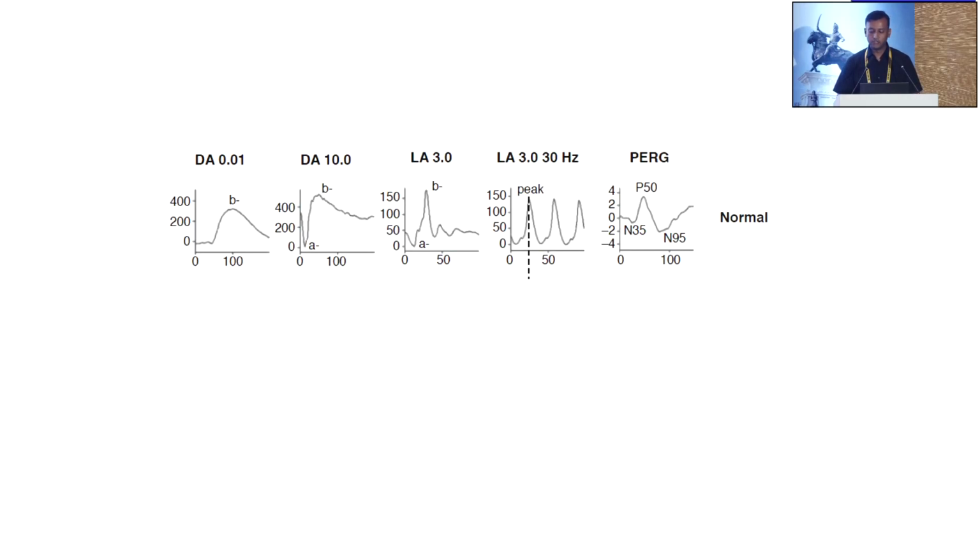And how do we confirm it? We do an ERG. This is how a normal waveform should look. This is the rod waveform, and from the complaints alone we know that we have to look at the rod waveforms because she is complaining of night vision problems. So this is how a normal rod waveform should look. A good A wave and a good B wave. B wave is always greater than the A wave.